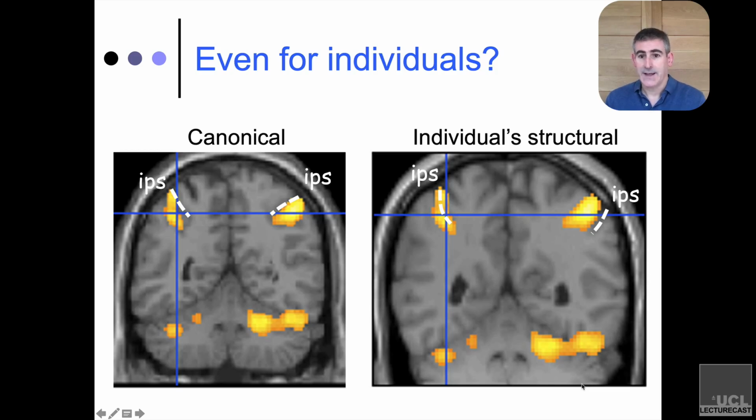It's not that Colin's anatomy is wrong. It's not. It's just that he wasn't in this study. The functional data don't come from him. So therefore, showing the functional data on his brain provides, one, an incorrect level of precision, and two, in some cases, incorrect localization because everybody's anatomy is slightly different. So my rationale here is please show the activations from your subjects on your subjects.